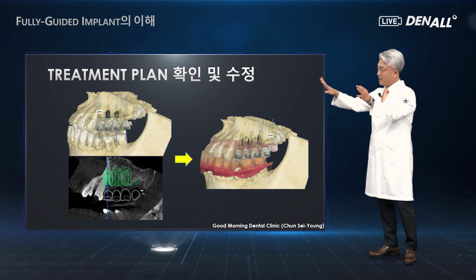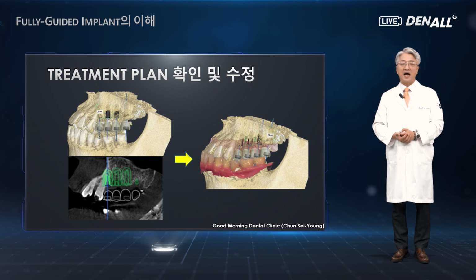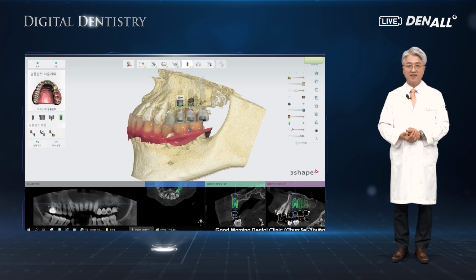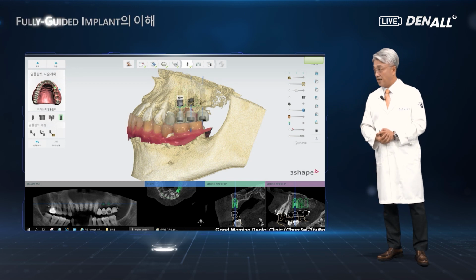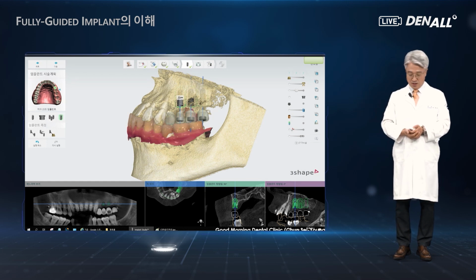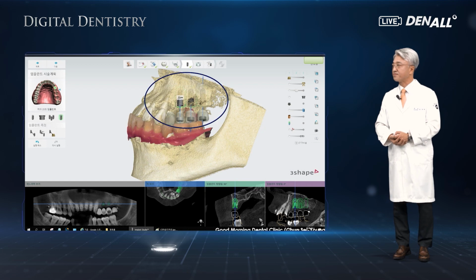So next, everything is inclined distally. For implant placement it is okay, and the prosthesis is okay as well. But among the prosthesis, abutment, and the fixture, the relation is not physiologically stable. Therefore, I boldly decided to remove number 24 implant and use 3 implants. The prosthesis with the cantilever bridge is designed, and I decided this would be the ideal, the optimal implant design.